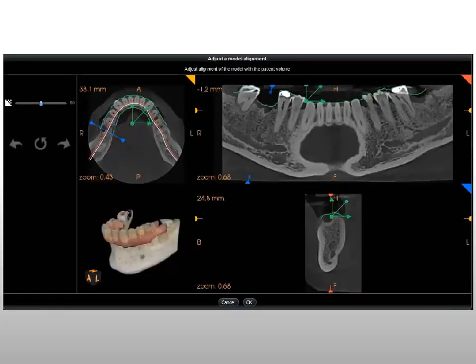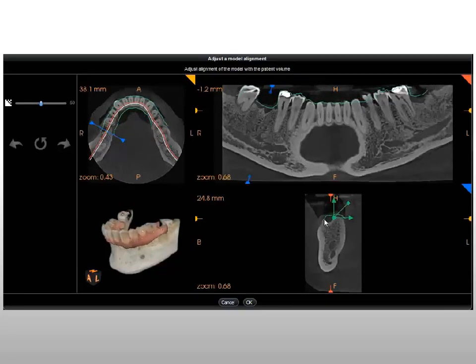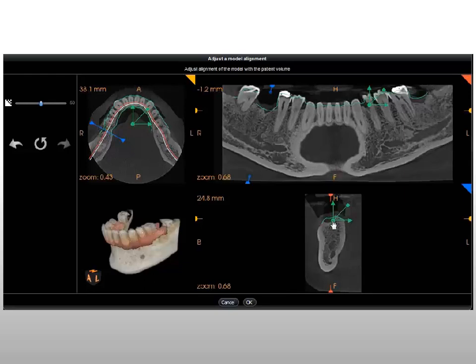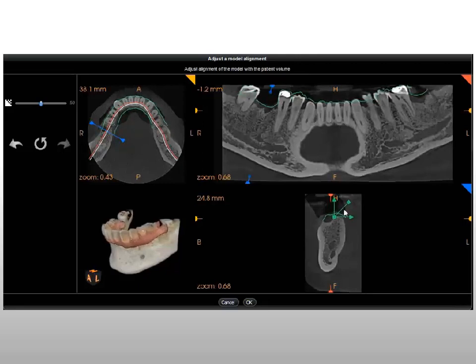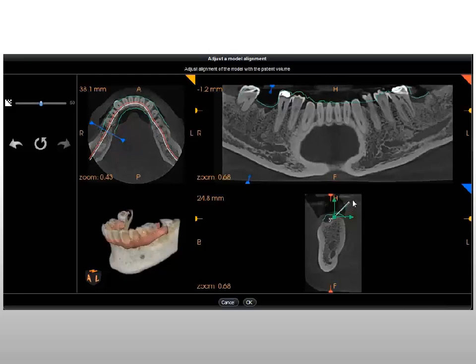To move the model, select the model outline or one of the grab handles and drag it to a new position. The grab handles enable constrained movement left and right, or up and down, to ensure greater precision when repositioning. To move an object without any directional constraint, click the omnidirectional grab handle. To rotate an object, select the rotation grab handle and drag the axis to a new position. To increase precision, drag the rotation grab handle outwards. As you rotate the model, the angle of rotation is displayed in real time.